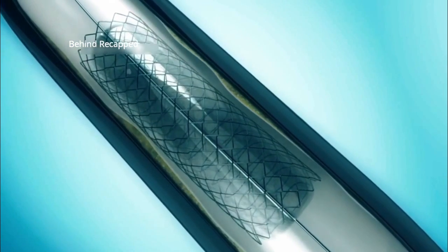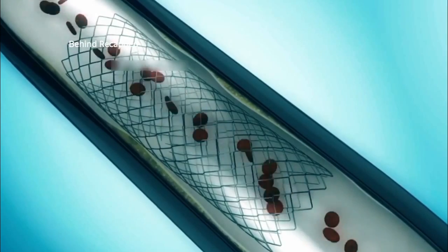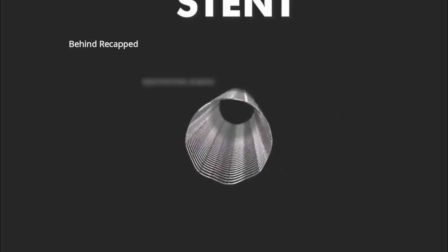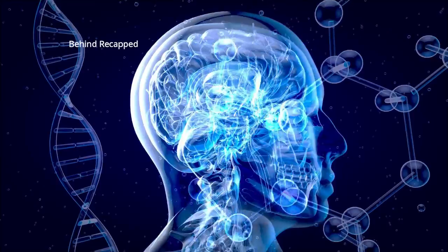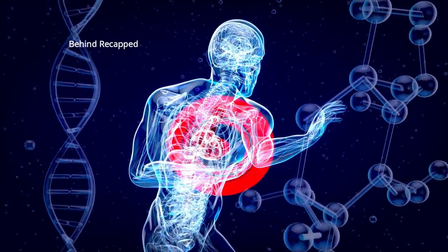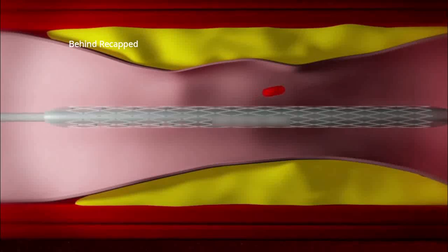In some cases, the catheter is also equipped with a thin steel mesh called a stent. Most people who have an angioplasty have a stent placed in their blocked artery during the same procedure. A stent, which looks like a tiny coil of wire mesh, supports the walls of your artery and helps prevent it from re-narrowing after the angioplasty. Here's what happens during a stent placement.